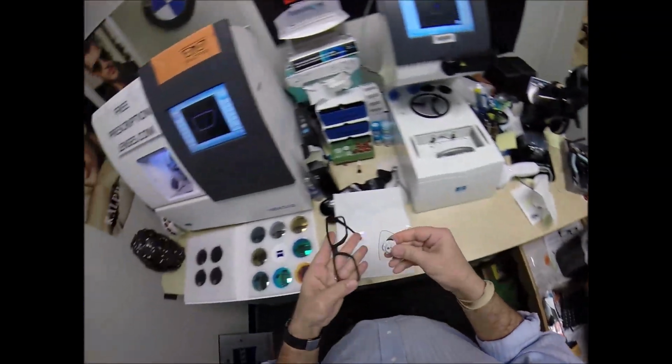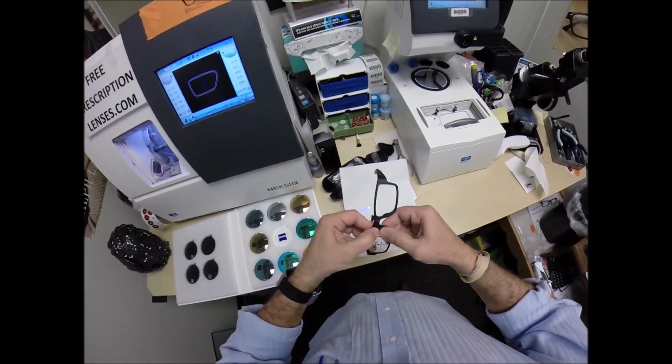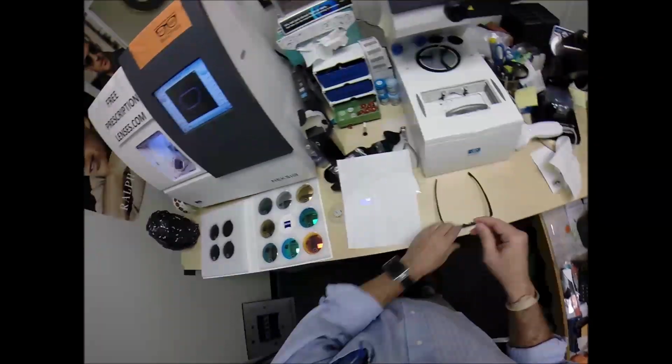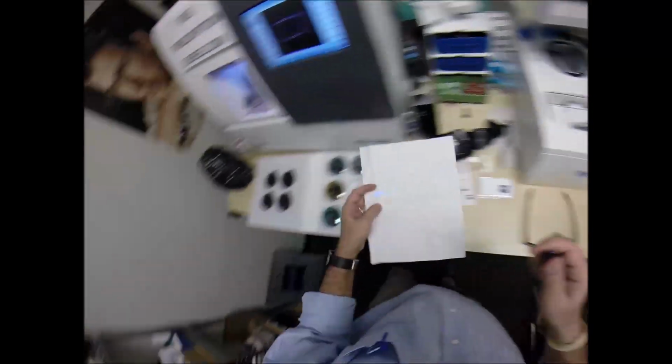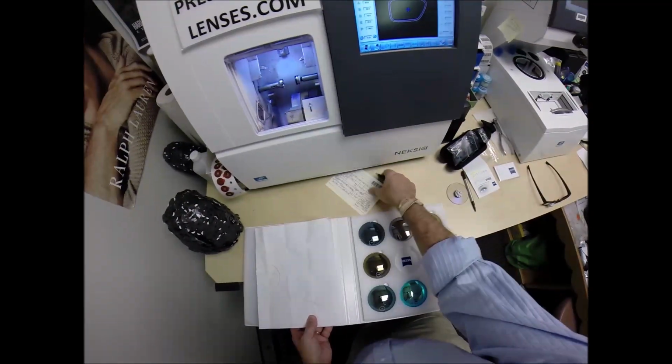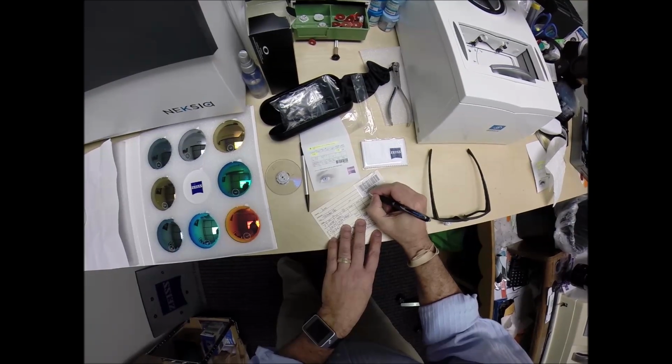That honey lemon. So again, we're going to tuck this in at the outside corner. Press down at the nose. Now it snaps in there easily. I'm going to mark on there, I took it off 0.2 of a millimeter. Where's your paperwork? It's around here somewhere. There it is. I took it down minus 0.20.